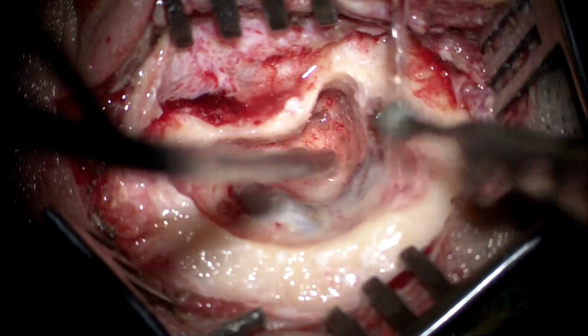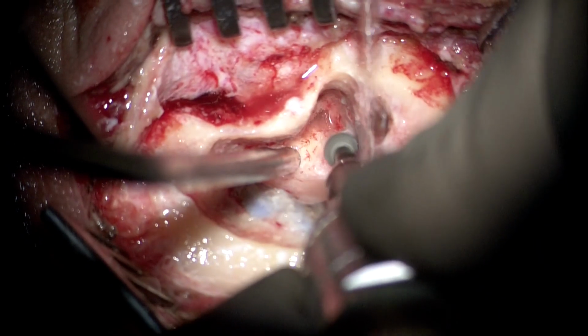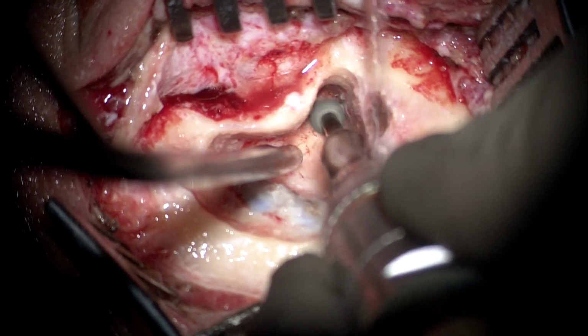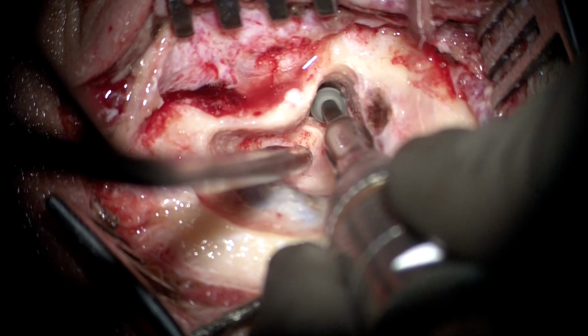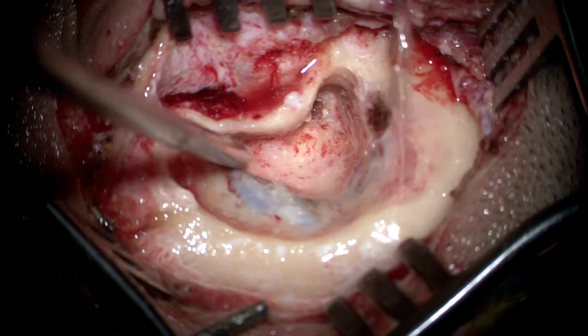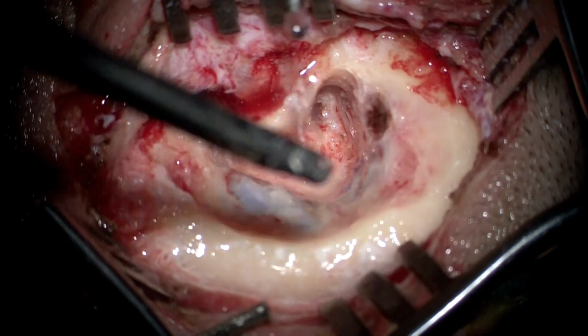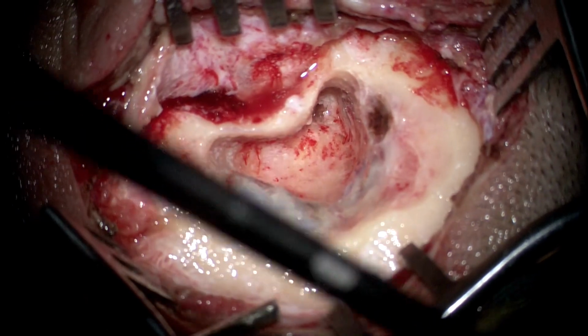Some more medial bone on the middle fossa dura also needs to be drilled with the same diamond burr to the level of just exposing the dura, not really damaging it, so that our exposure towards the superior canal, which sometimes is literally in contact with the middle fossa dural plate, is made adequately.